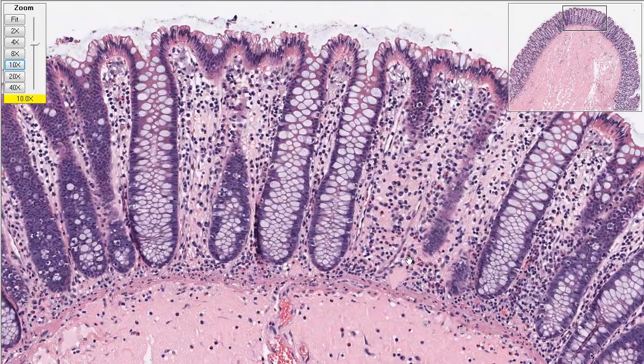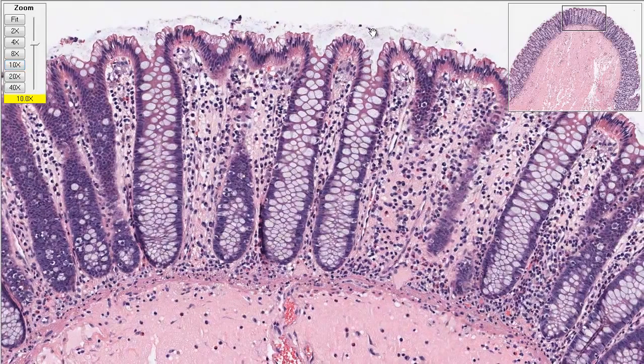Gives us the looking at the, and the word here is mucosa. Mucosa, very similar to mucus. So the idea of mucosa is it's the lining that makes the mucus, which is the slimy part. I see. So this stuff up here is the slimy mucus, and it keeps the linings of the insides from drying out because it's a very hydrated gel. But it also means that things can glide along without abrading the surface.